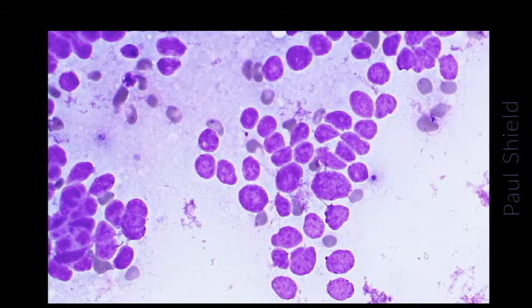Higher power, you can see actually there's quite a bit of variation in size and shape of nuclei here. Some quite large ones next to fairly much smaller ones. And some of them are round, some of them are irregular. Look at this, chains of cells running down like this, and they're moulding around each other, just like vertebrae in a vertebral column. I can't see any cytoplasm on the cells. There's some very, very tight groups there, some single cells.